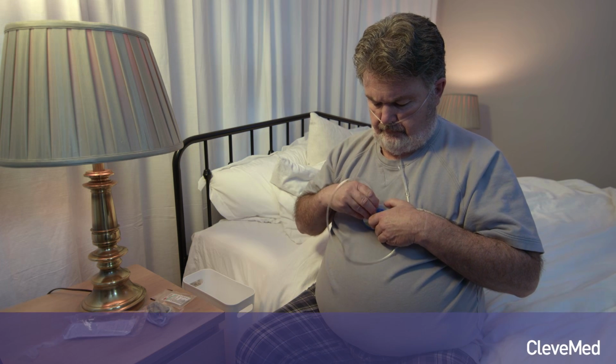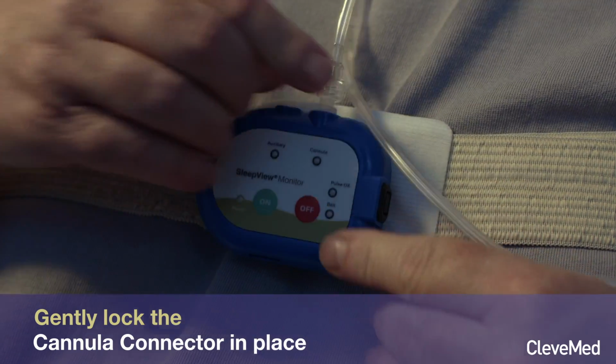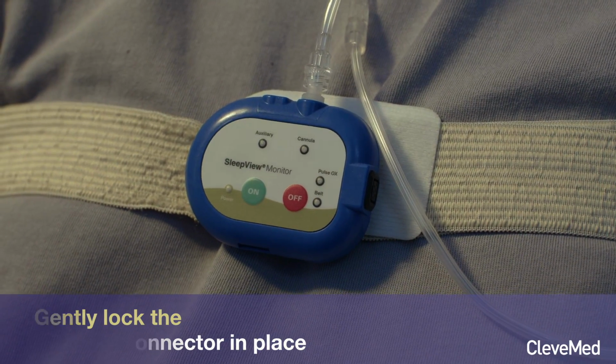You may use adhesive strips to secure the tubes at your cheeks. Connect the end of the nasal cannula to the cannula connector. Once inserted, gently turn the connector clockwise to lock it in place.